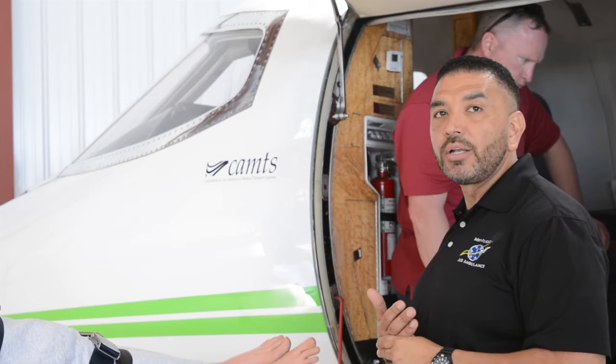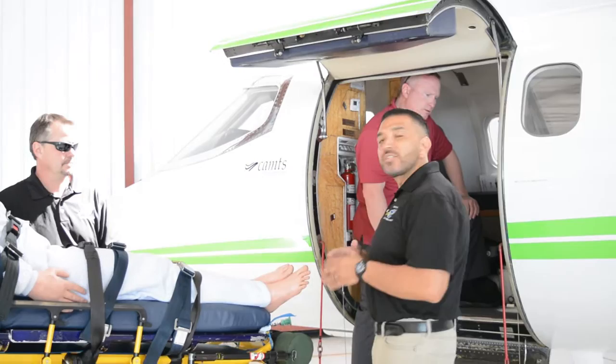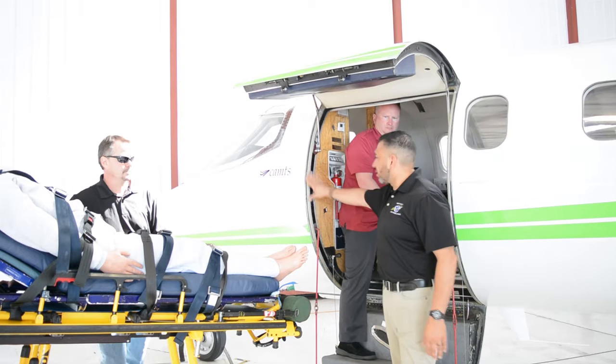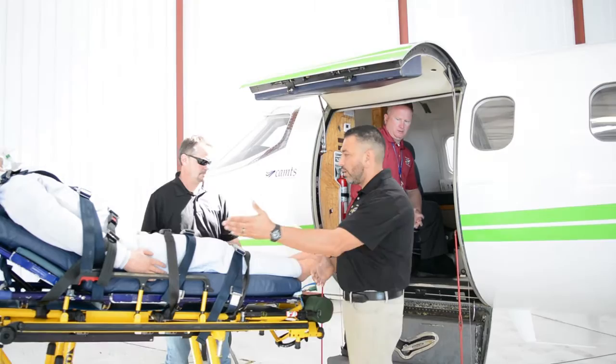So once we're ready to go, we're going to make sure that we're bringing the patient to the ambulance. Usually the flight medic is going to be positioned right where I am. This is a good place to post so we can watch our door frame and make sure that our gaskets aren't going to be hit. And usually our other EMS providers that are helping are going to be where Greg is right now, and if we have additional on the sides.